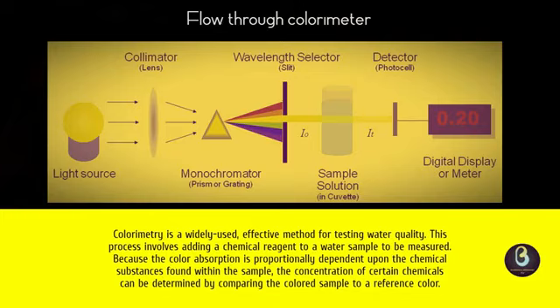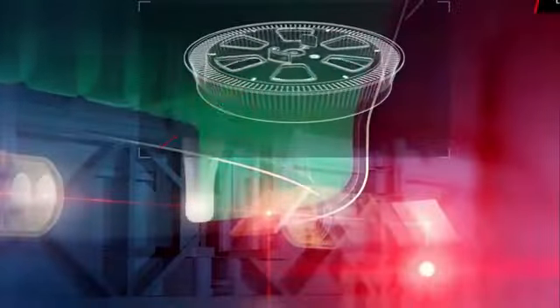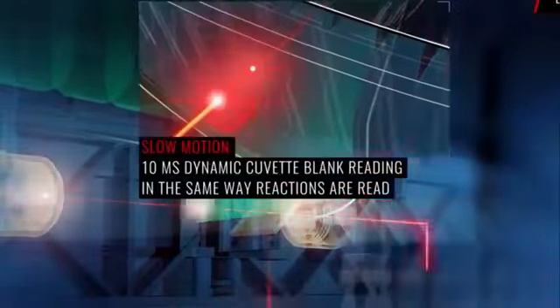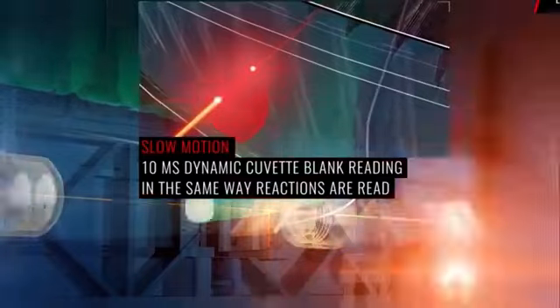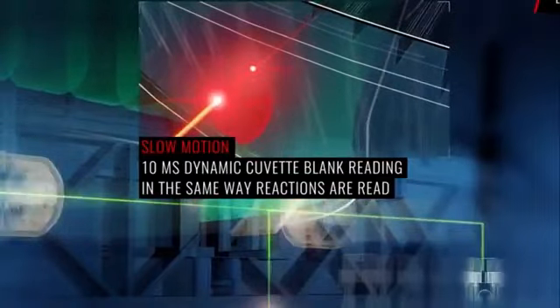And last but not the least component is the recorder assembly. The servopotentiometer recorder is used to record the ratio of the responses from the two detectors, and these responses are proportional to the intensity of light reaching the detectors, and to send it to the CPU for analyzing data and display the results on the device.